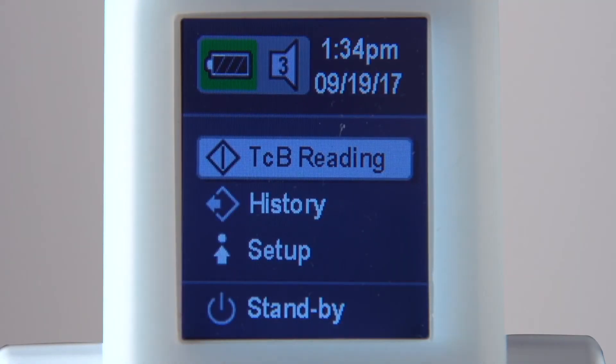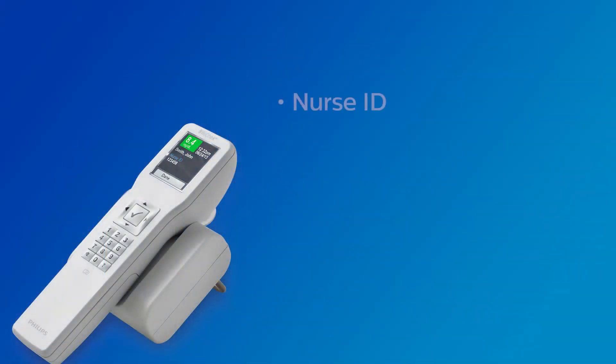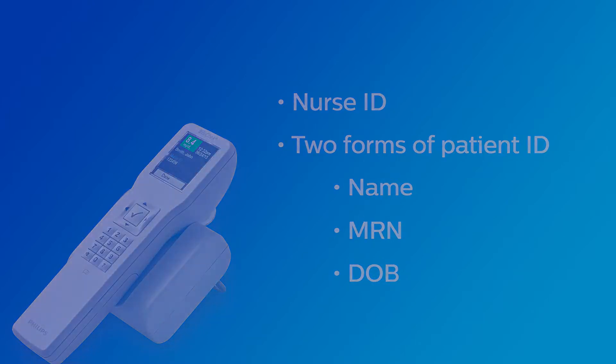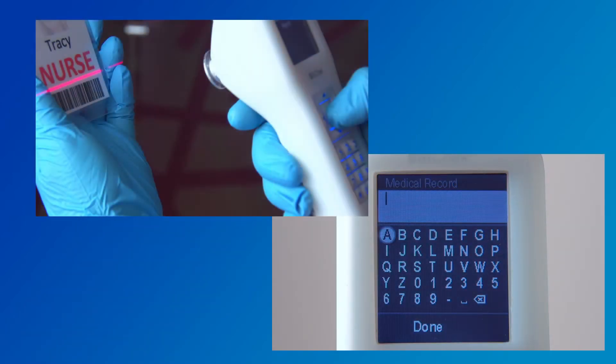From the home screen, select TCB Reading. Enter a nurse ID and two of the following forms of patient ID: patient name, patient medical record number, or patient date of birth. Enter the information using either the on-screen keyboard or use the barcode scanner.